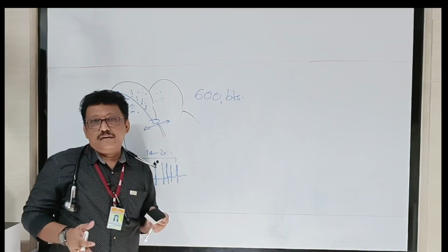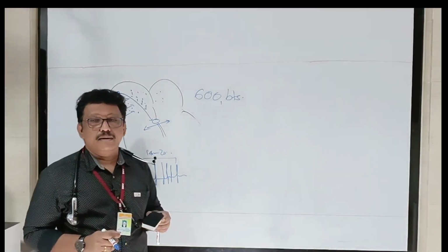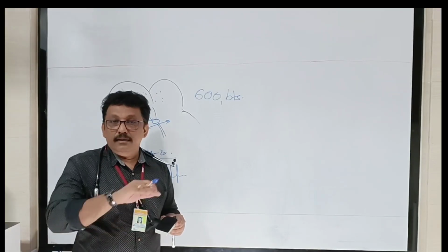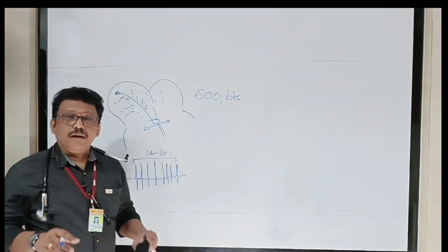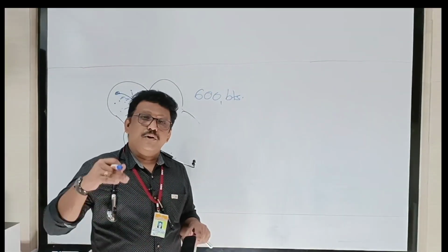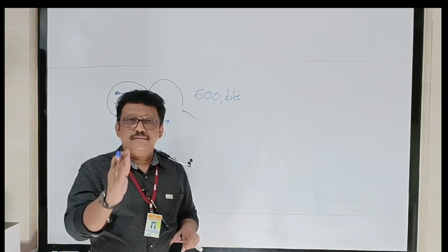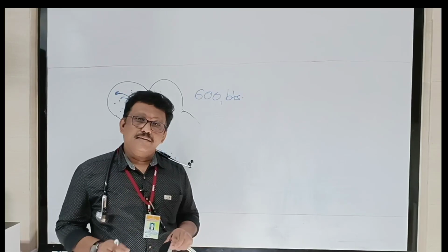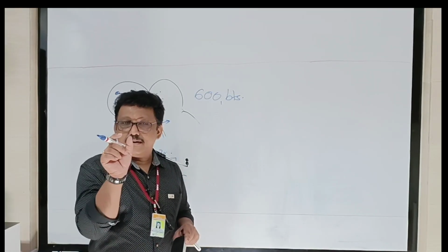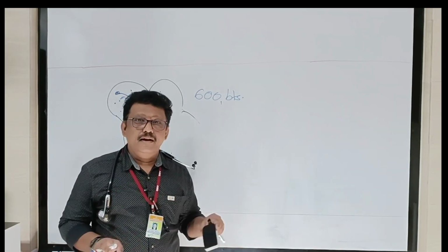Irregular QRS complex. That is very important in atrial fibrillation. So irregular QRS complex is occurring. There is wavy baseline. Sometimes you cannot see the baseline at all. It may sometimes be flat, because in chronic atrial fibrillation you don't see wavy baseline. But the QRS complex is irregular. So in an ECG, if you are seeing irregular QRS complex, and the QRS complexes are narrow, that means less than 3 small squares, then that is definitely atrial fibrillation.